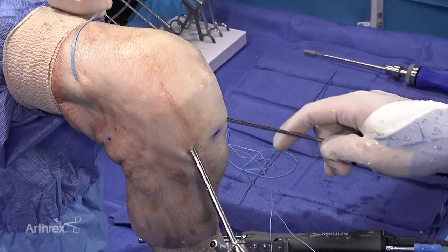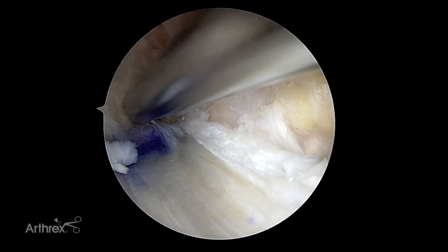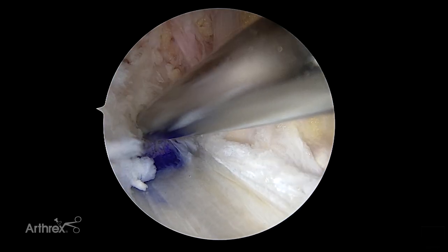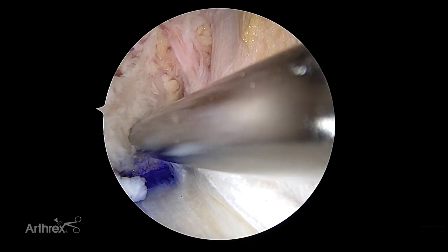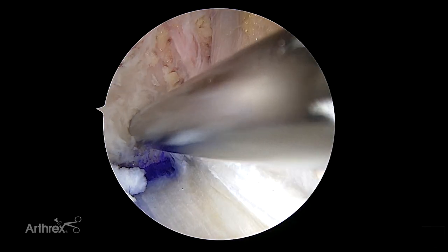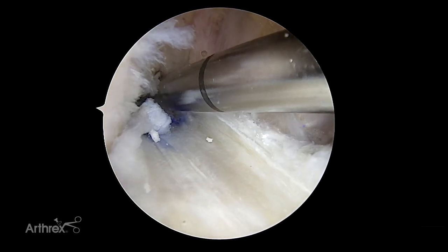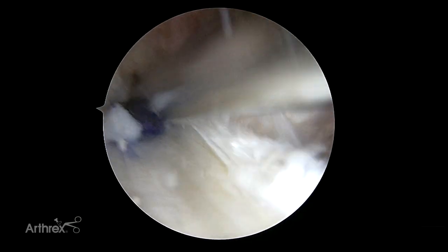We're now introducing our dilator. The important step is to reproduce collinearity — that looks like a pretty collinear angle here. It's important to place the dilator half on and half out of your tunnel, right next to the tunnel, so it creates its own channel just adjacent to the socket. In this position, we can mallet it in. The pre-marking gives us that 20 millimeter mark.